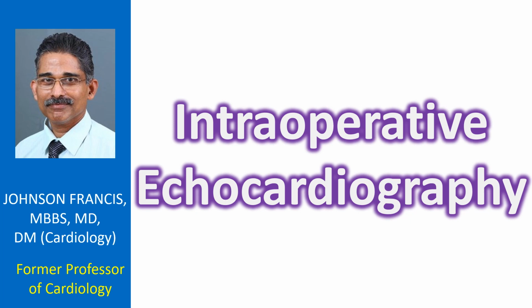More and more complex surgeries and redo operations make intraoperative transesophageal echocardiography an essential guide for surgical procedures. Cardiac anesthesiologists have acquired the skill of providing good intraoperative TEE imaging for the surgeons. With the advent of live 3D imaging, this is all the more important. In a difficult case, rarely cardiac imaging specialists may be called into the theatre.